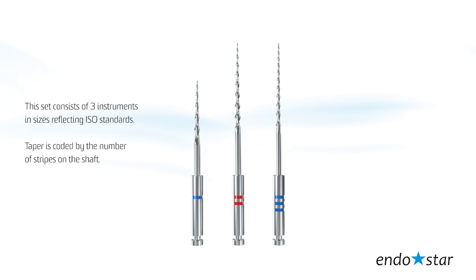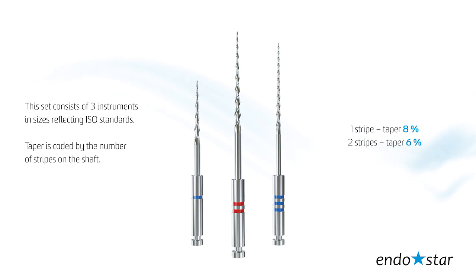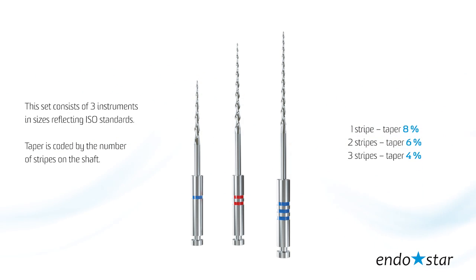Taper is coded by the number of stripes on the shaft. One stripe, taper 8. Two stripes, taper 6. Three stripes, taper 4.